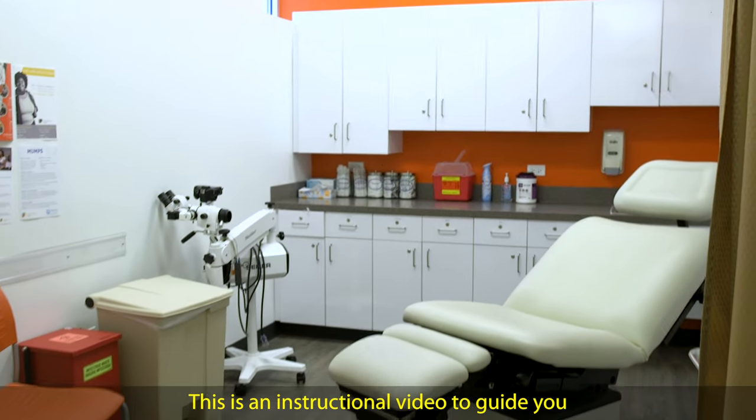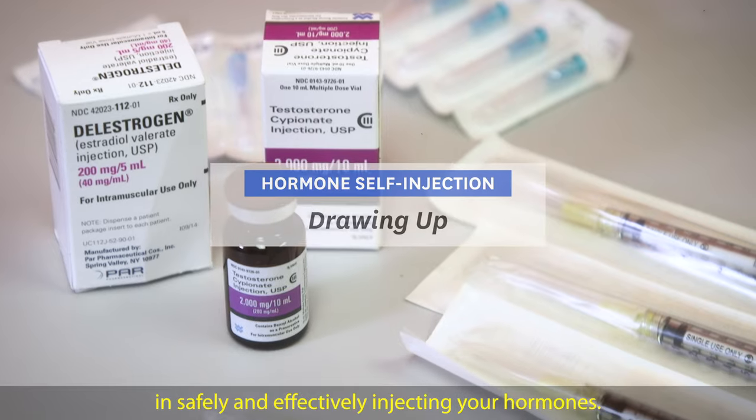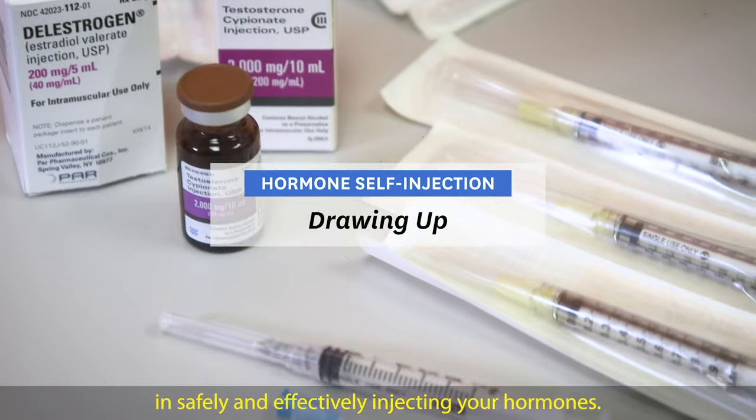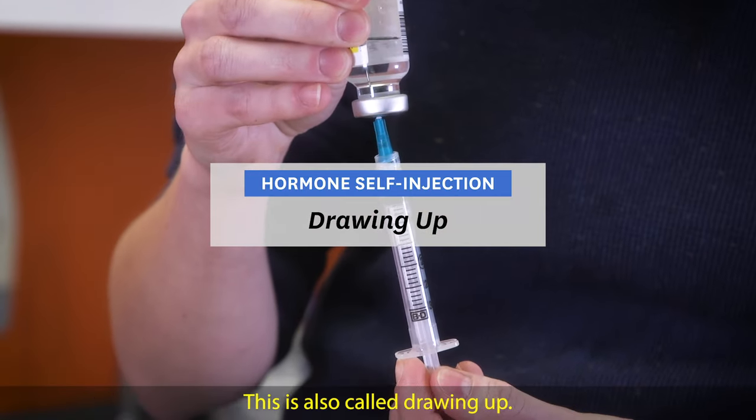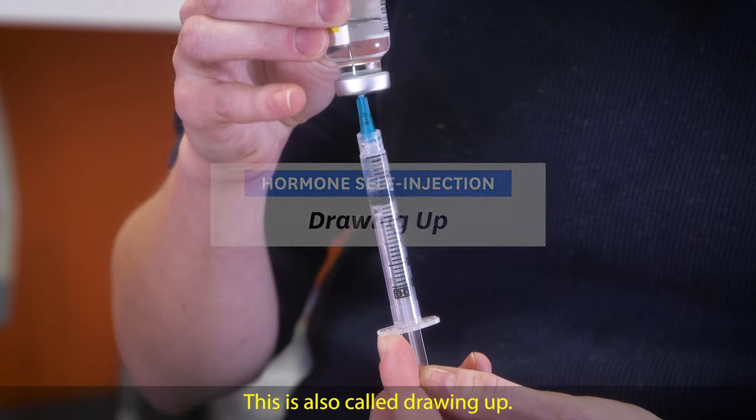This is an instructional video to guide you in safely and effectively injecting your hormones. This video covers how to prepare the syringe for your injection, also called drawing up.